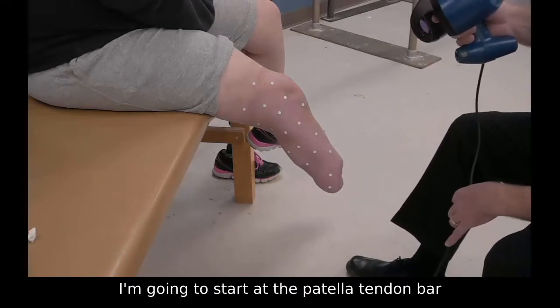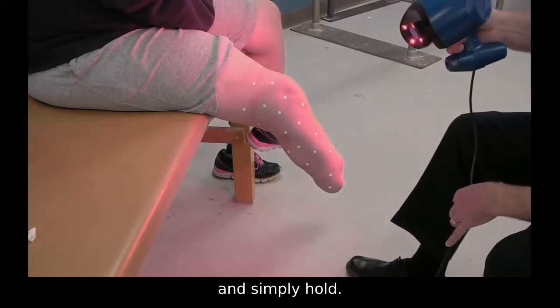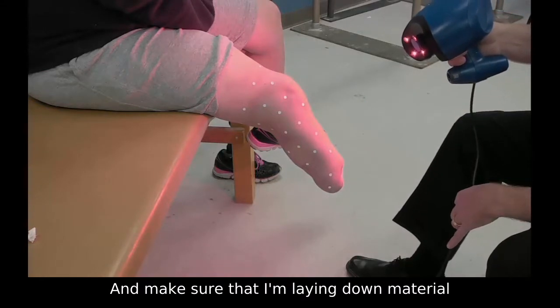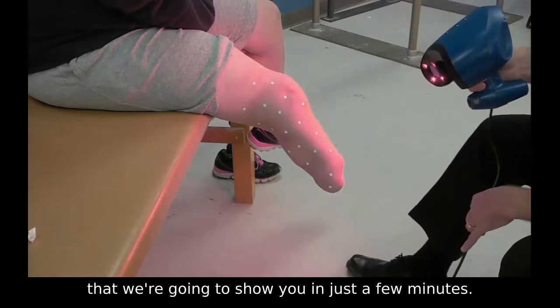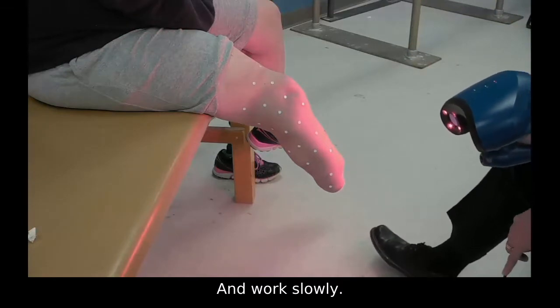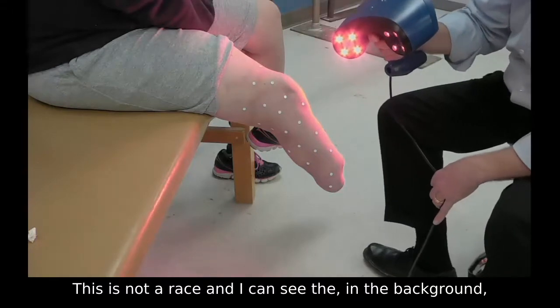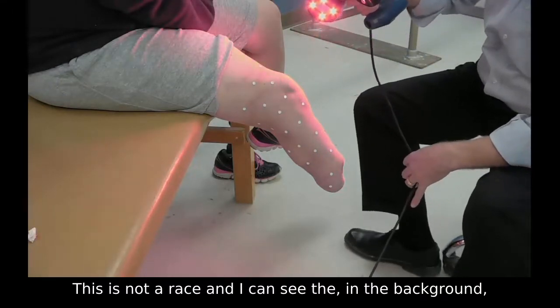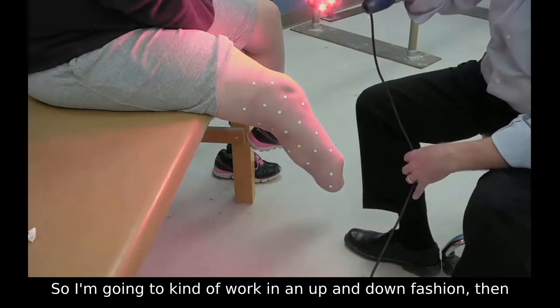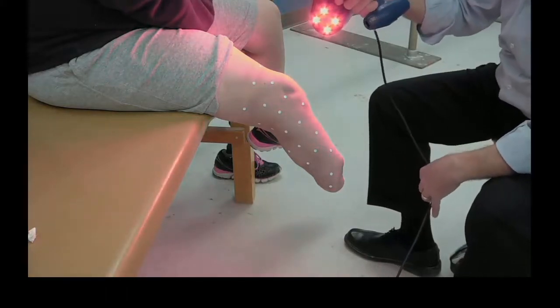I'm going to start at the patella tendon bar and simply hold and make sure that I'm laying down material that we're going to show you in just a few minutes. And work slowly. This is not a race. And I can see in the background the computer monitor. So I'm going to kind of work in an up and down fashion and go back and forth.